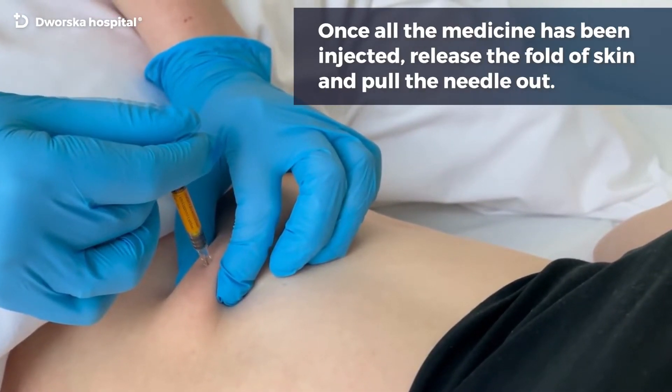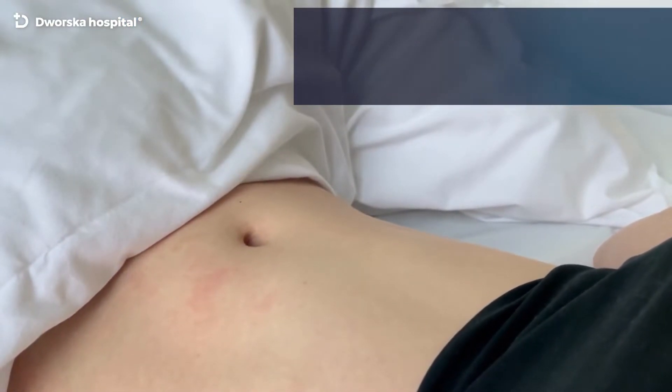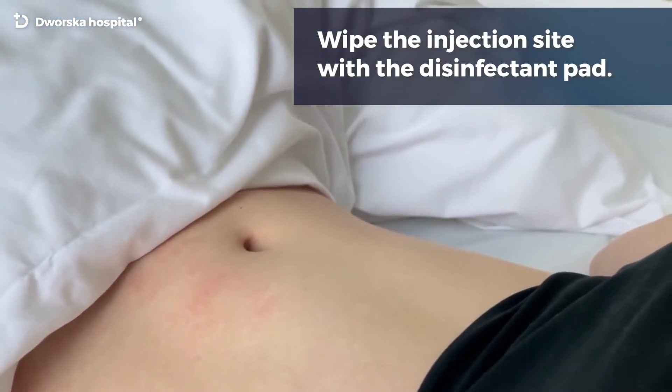Once all the medicine has been injected, release the fold of skin and pull the needle out. Wipe the injection site with the disinfectant pad.